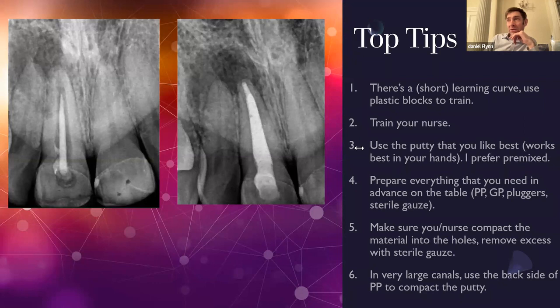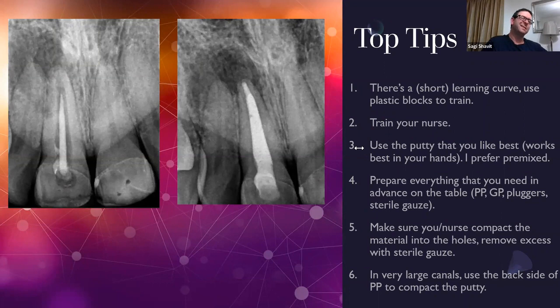Exactly. And now with all these pellet formers and such, the time actually isn't a big issue. It's very quick to seal these up. There is a guy out there on Facebook who's doing them in a single visit. I have a bit of a question, going from the triple antibiotic paste to calcium hydroxide. What is your view, by the way, about the triple antibiotic paste?